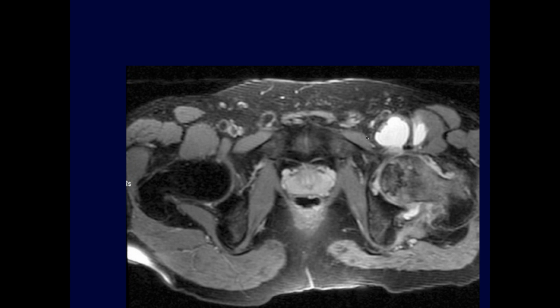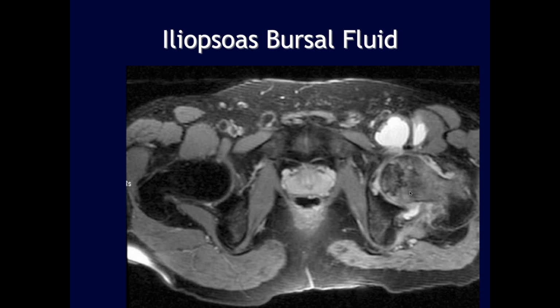Okay, so on the left hip, we have a large amount of edema, actually kind of fluid collection within the iliopsoas myotendinous junction. It actually looks like it's intramuscular, so I wouldn't call it bursal effusion. I don't know if there's at least partial tear with cyst formation. This follows right down one tendon. Okay. Patient also has pain. Oh yeah. So the left hip's also markedly abnormal.